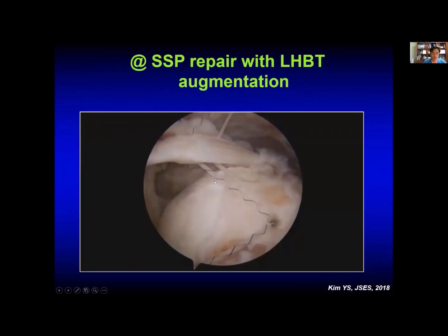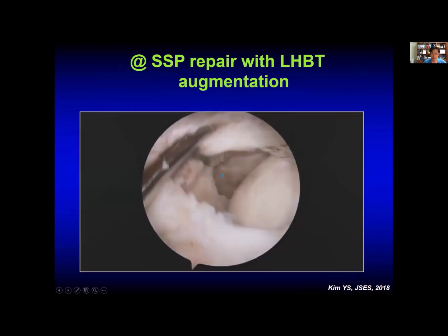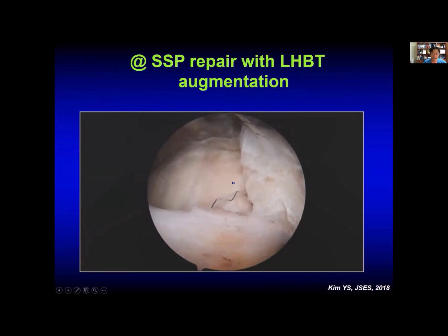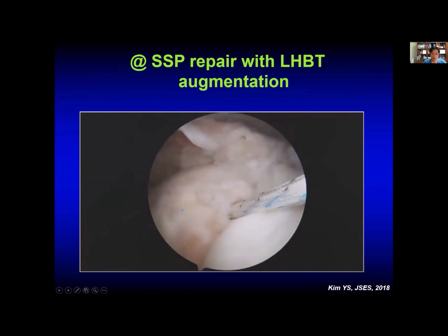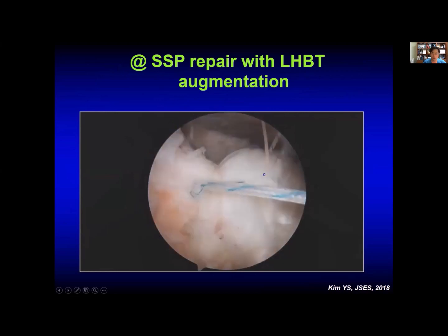This video shows a conventional biceps augmentation technique. Cut the original biceps tendon, repair the cut end of the cuff tendon, and tie the knot. Then insert the medial anchor just after the articular cartilage and suture the torn tendon cuff with the biceps tendon.